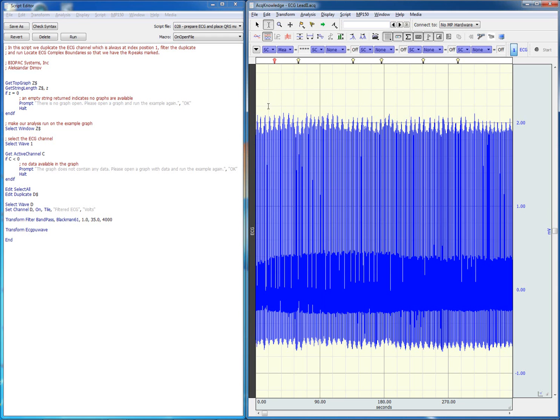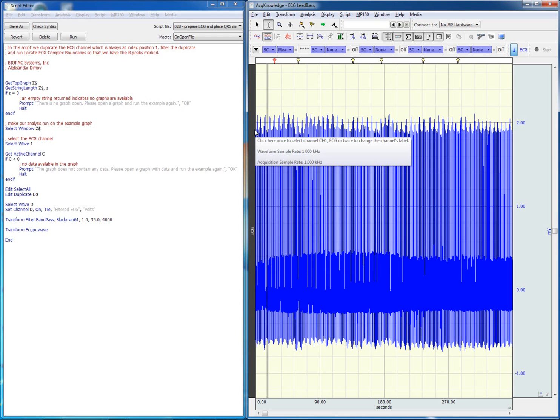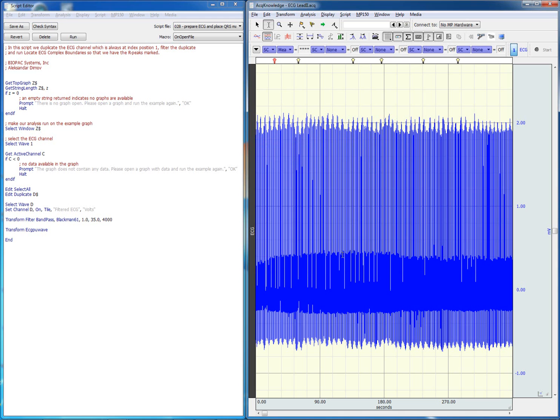The first script we're going to run will duplicate the ECG channel, filter it and run the ECG complex boundaries algorithm.